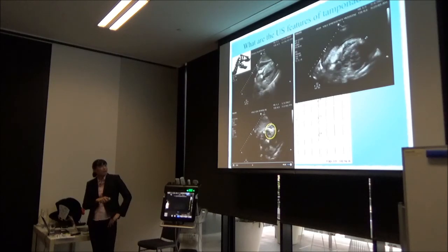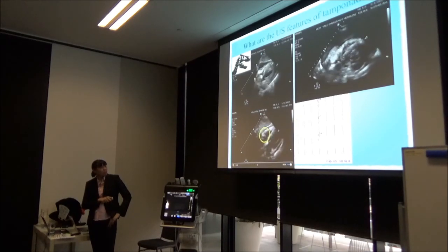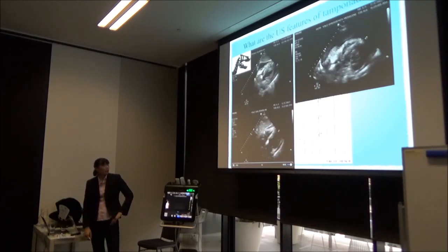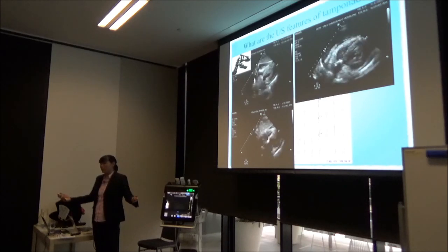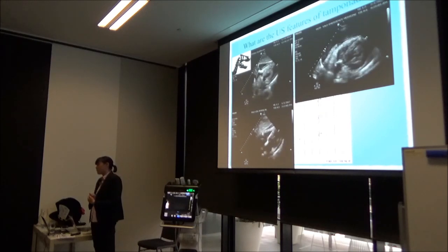Okay. I'm specifically looking in diastole though. Diastole is when the valves open. So I'm going to remove this because it's distracting. When the valves are open, is the RV dilating all the way? I don't think this is tamponade. Do you guys agree?